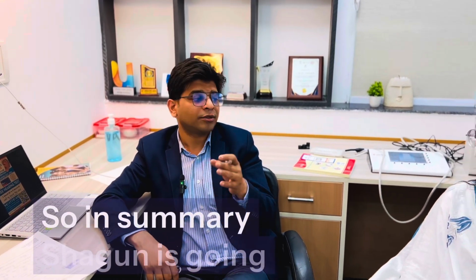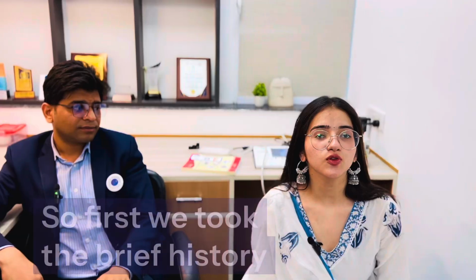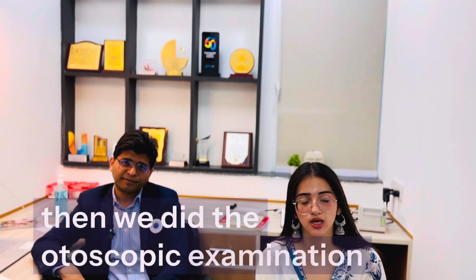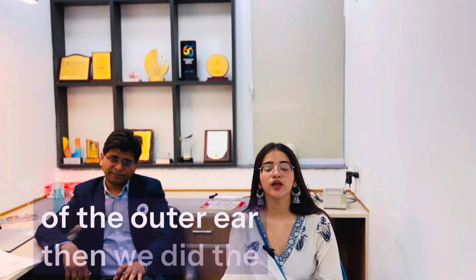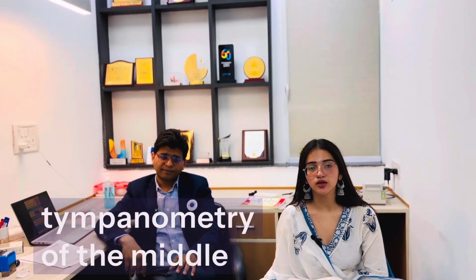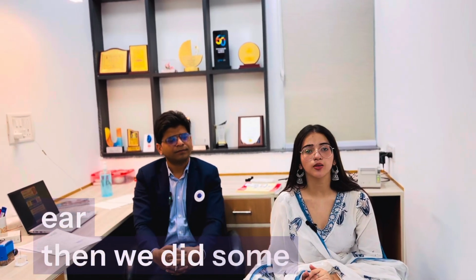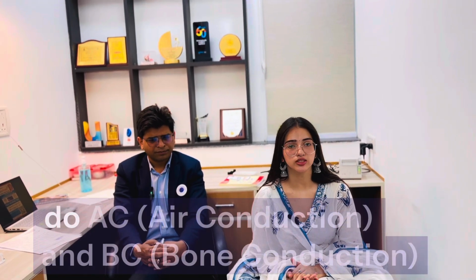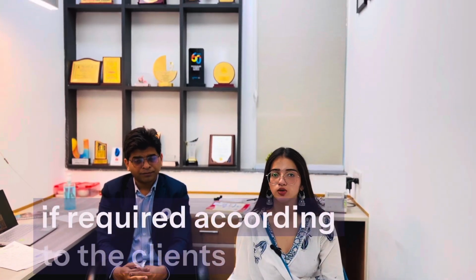So in summary, Shagun is going to tell us what all we did. So first we took the brief history, then we did the otoscopic examination of the outer ear, then we did the tympanometry of the middle ear, then we did some tuning fork test, and then we went for the PTA to do AC and BC and speech audiometry. We can even do masking if required according to the client.